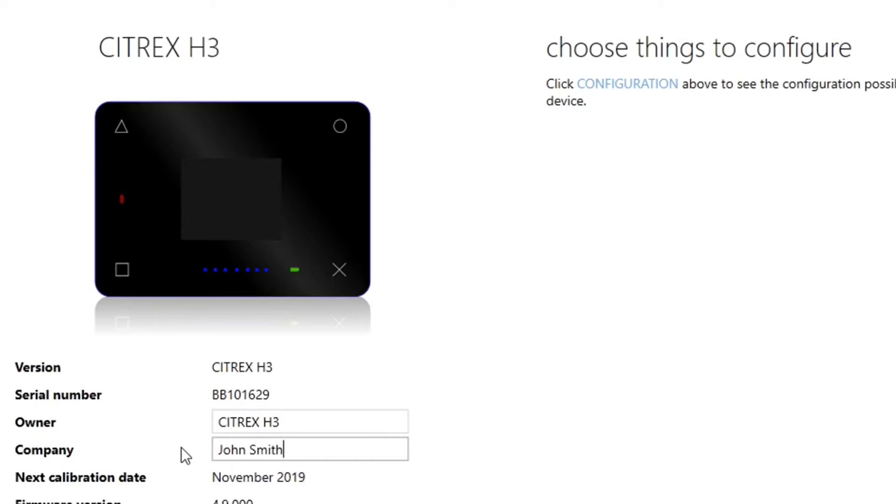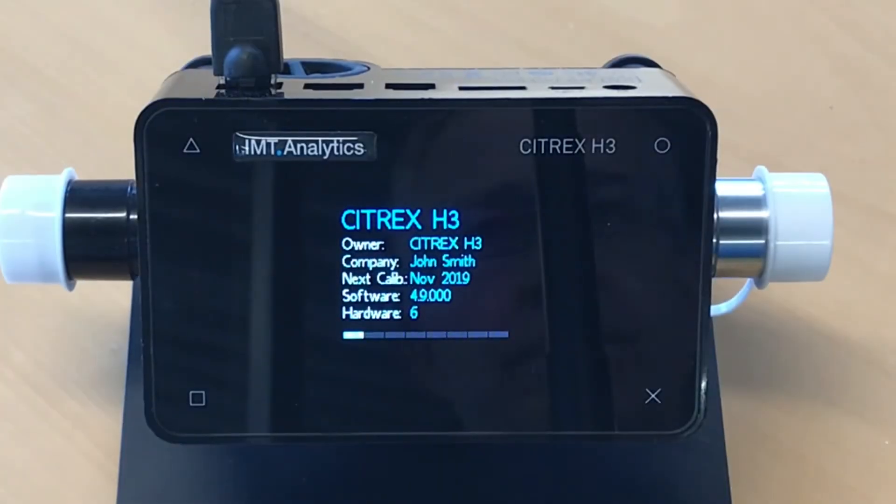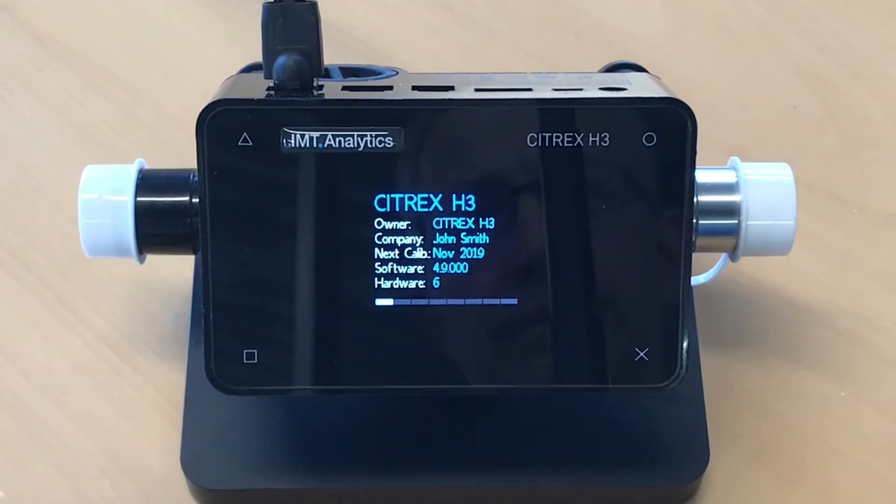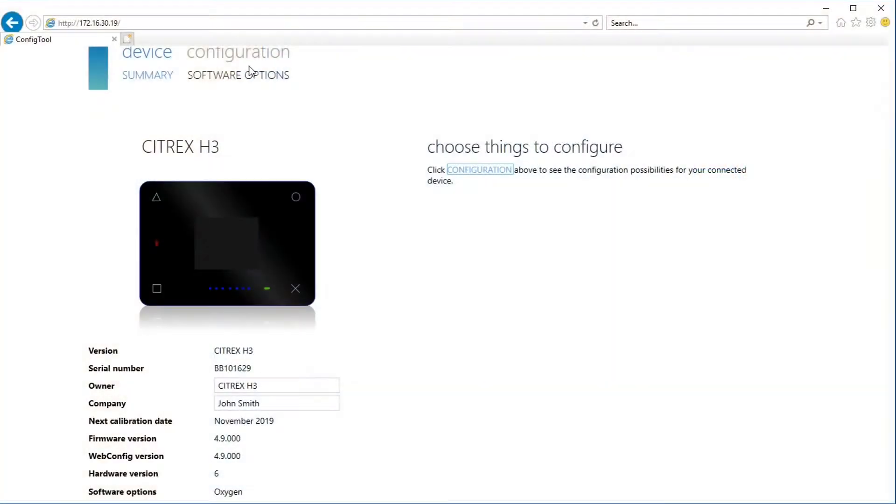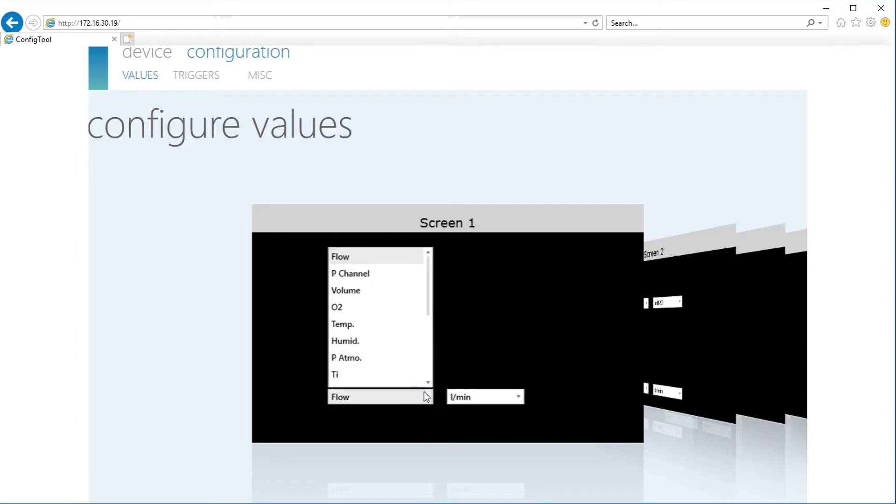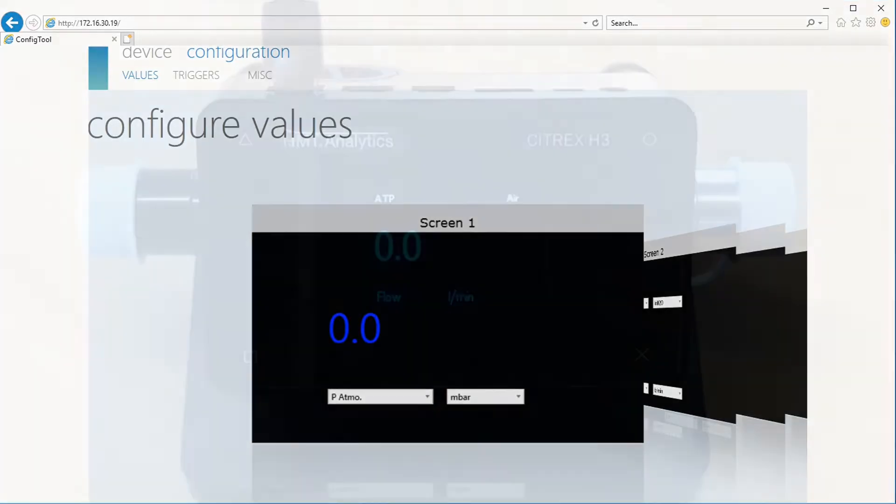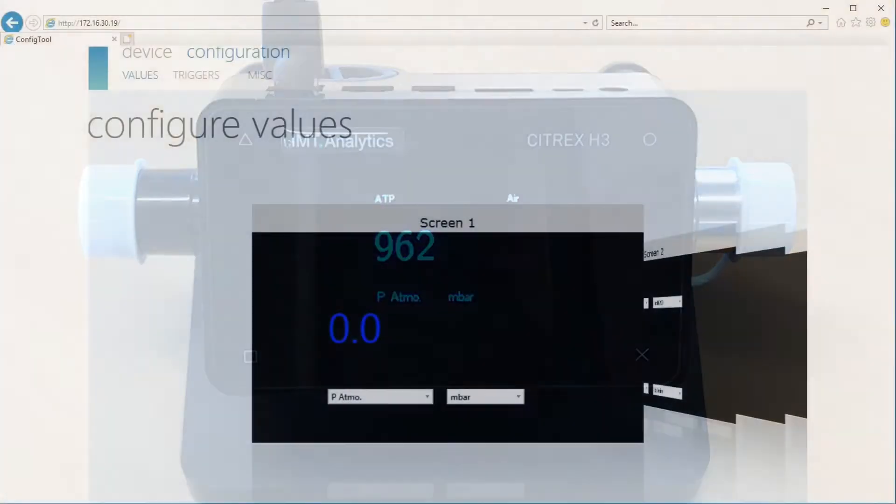Now you can change some parameters like the name of your device, but also, which is actually more important, you can select or configure all the screens via web browser. It's much more comfortable to change the parameters on your screen in the web browser.